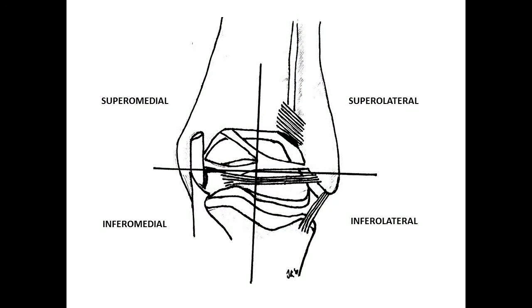It is important to have a systematic approach when performing any surgical procedure. This is particularly true for hindfoot endoscopy. This four-quadrant technique provides a structured approach for identifying hindfoot pathologies under arthroscopic surgery.